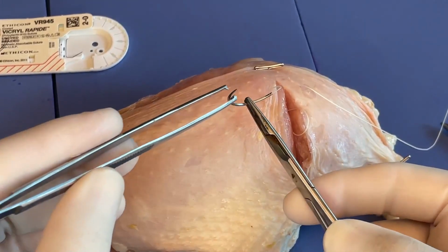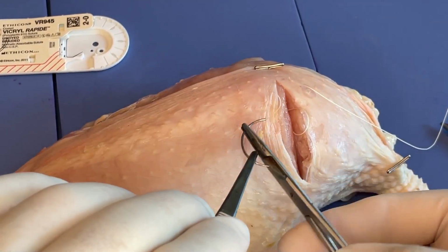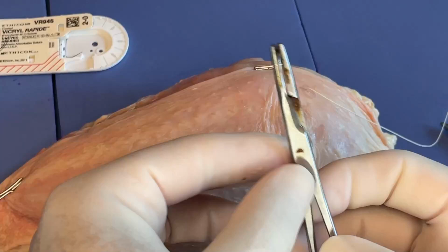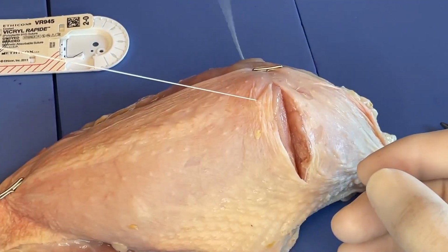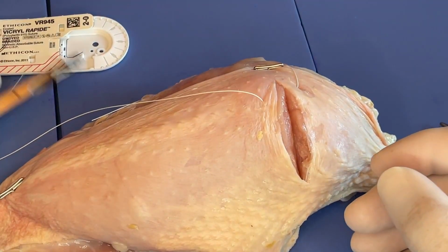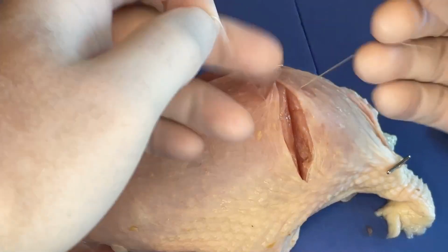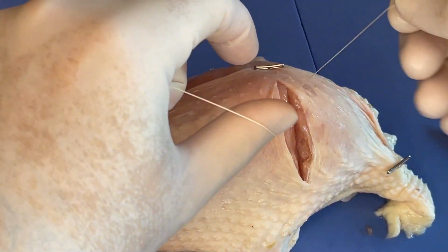Now, if I'm going to be tying this, I want to protect the needle if I'm going to be setting it down, or even just really holding on to it. So we'll pull our suture through. I'm going to set the needle driver down, and then we're just going to do a very simple two-handed knot.